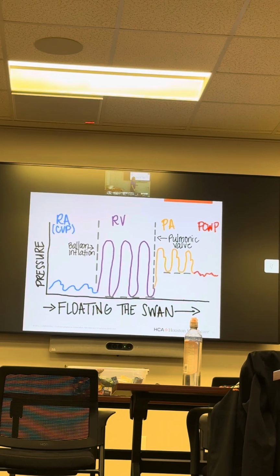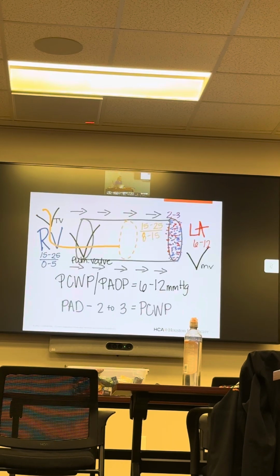Again, the surgeon's going to be real sweet to you. They're just so happy you're recovering their patient. And they call and they say, what's my patient's cardiac output, or how's my patient doing? You say, well, the cardiac output is this. And they say, what's the index? That's all they care about. And then they say, what are my PA pressures? And you say, oh, in the 30s. What's my PA diastolic? Because that's the information they're going to care about. So, why do they care about PA diastolic? Because it is a conduit for our wedge pressure.